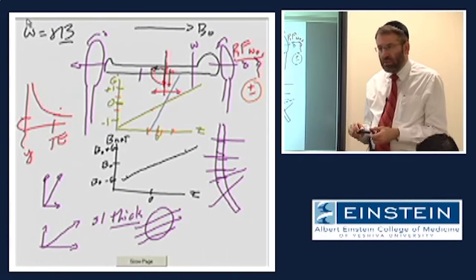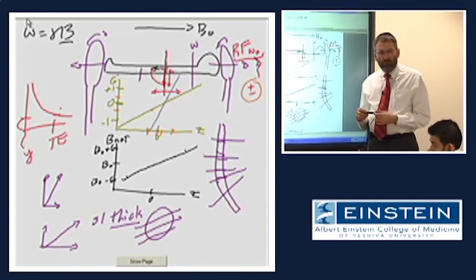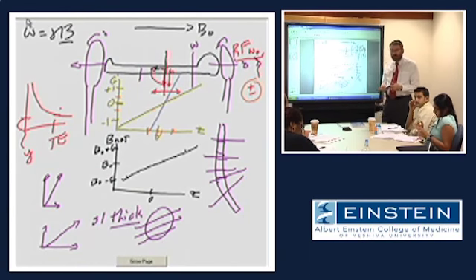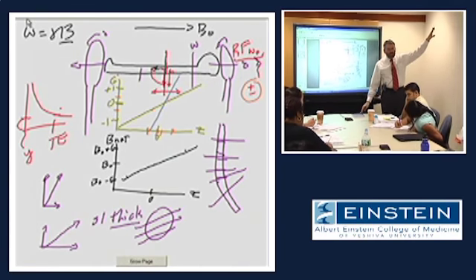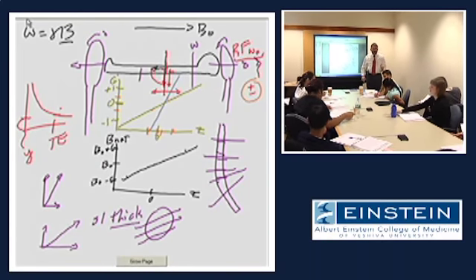Any questions about this? When you change the strength of the gradients, does the isocenter compared to the green and purple line change? No. It stays the same. Sorry if I didn't draw it accurately to scale. The isocenter is always the isocenter. So the gradient magnetic field is simply changing its slope, pivoting around the isocenter. The isocenter never changes.